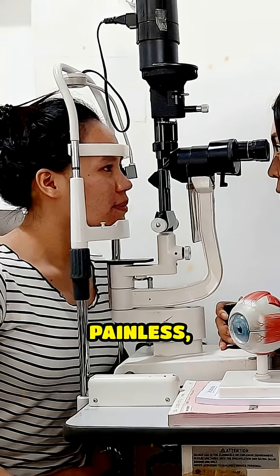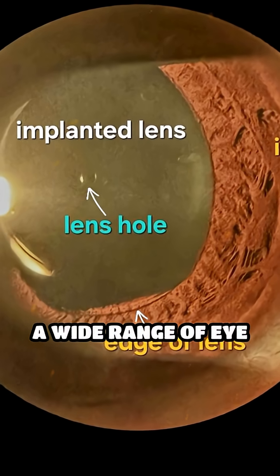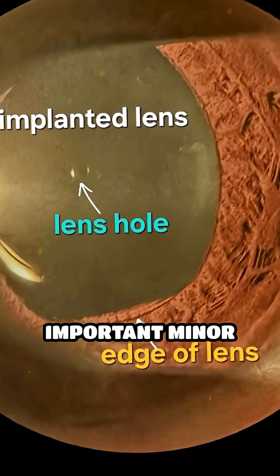The slit lamp test is painless, quick, and essential for diagnosing a wide range of eye conditions and doing important minor procedures.